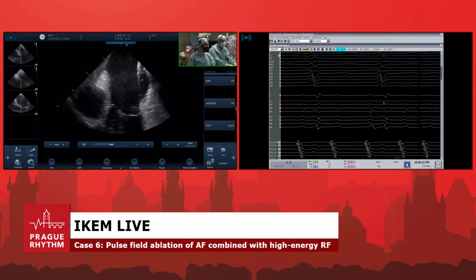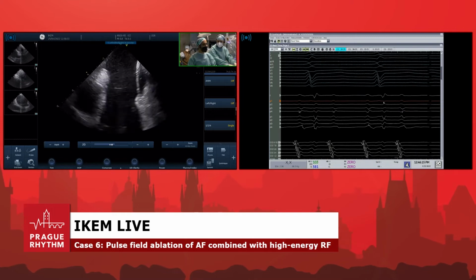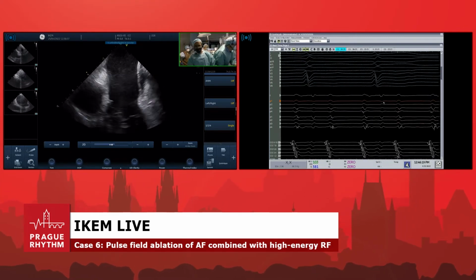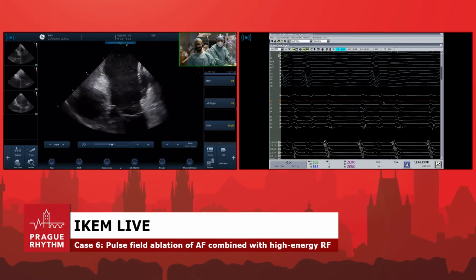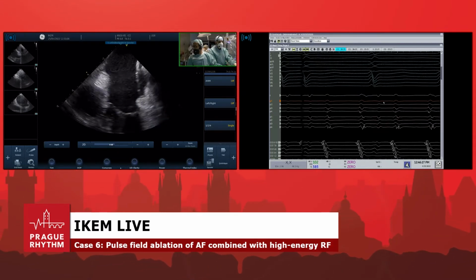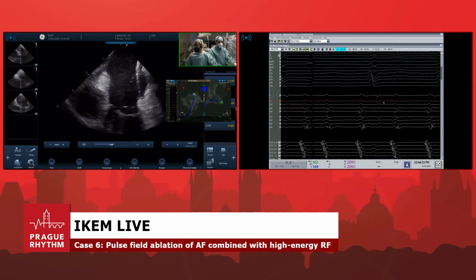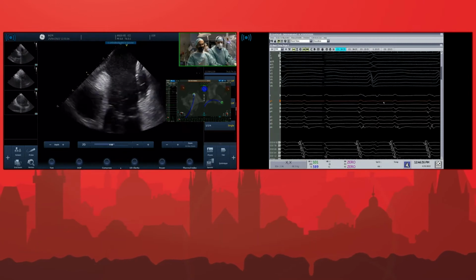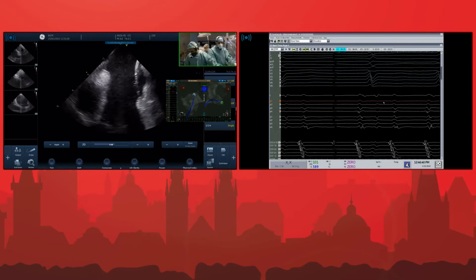Maybe you're fine. We can start here. Okay. You see the ICE, you see the balloon, you see the isthmus. So if you remember the isthmus from yesterday, the CTI from yesterday was half the length of this isthmus, which is quite long. But you can see also the large footprint of the catheter, and if you calculate it, you probably have 6-8 lesions here to cover the entire CTI.